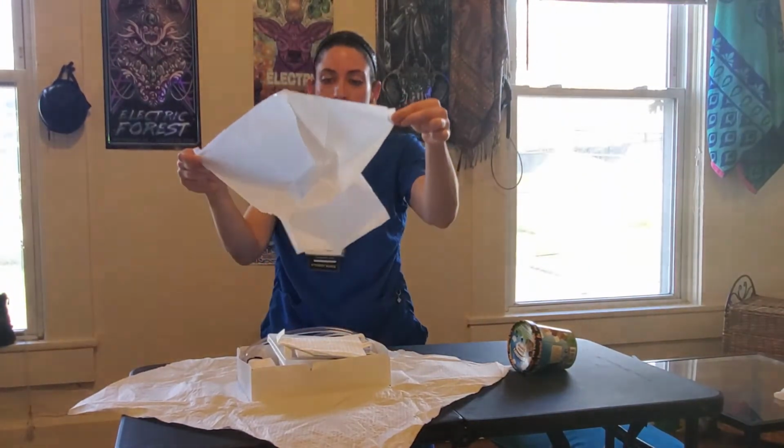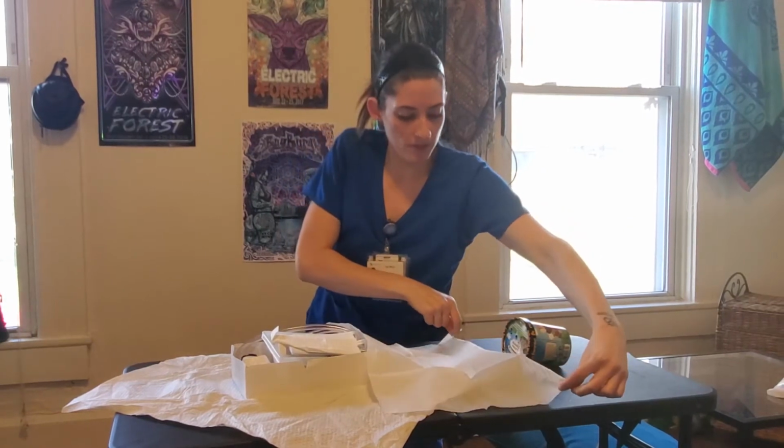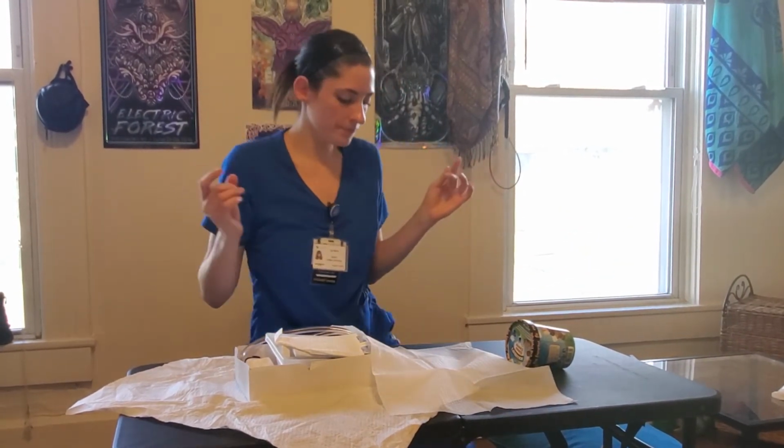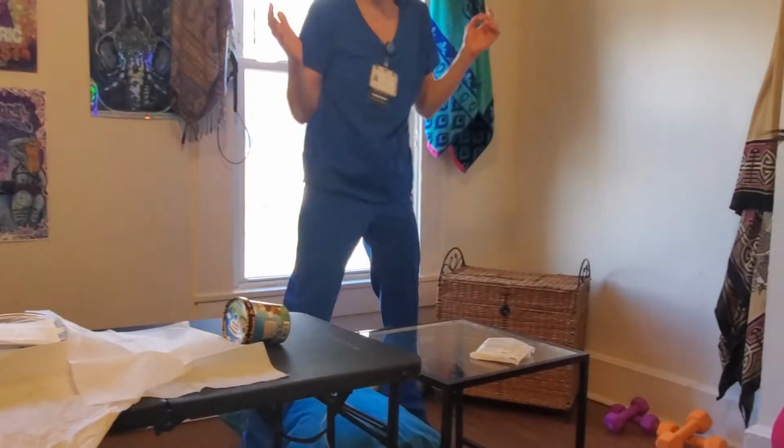We want the shiny side facing towards me, and we're going to drape it between the patient's legs. Now I'm going to don sterile gloves. So I'm keeping the sterile field within my line of sight.